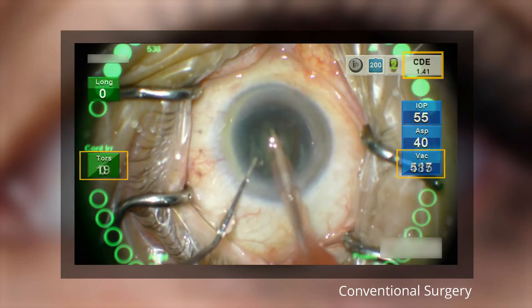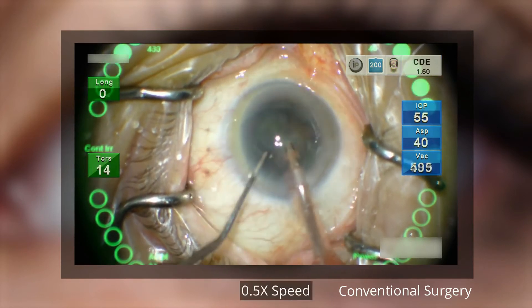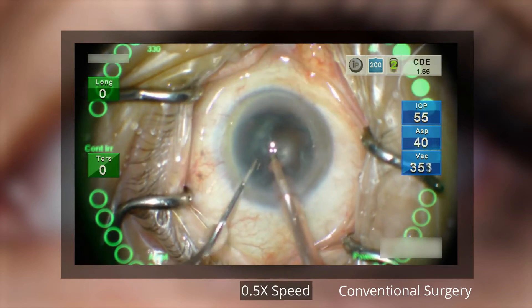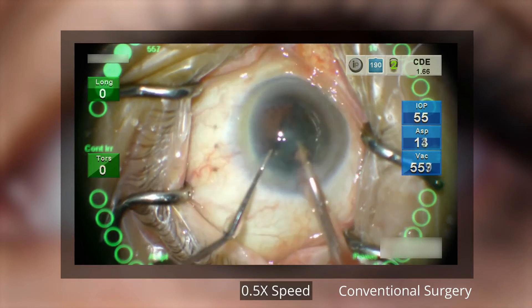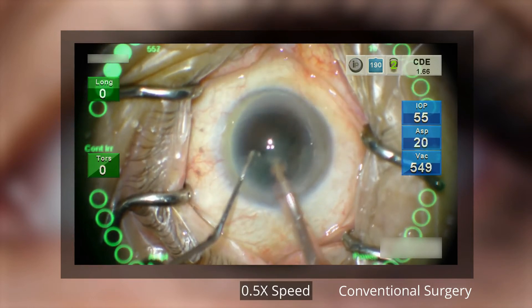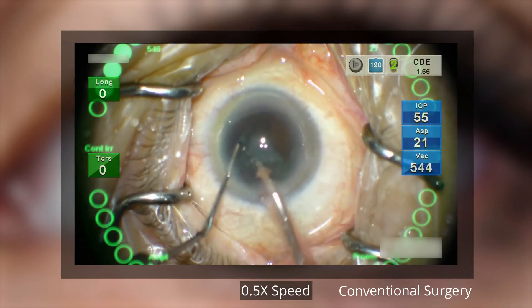The torsional ultrasound power is delivered when the vacuum is engaged. Irrigation flow from the sleeve is directed to the sides, which is important for avoiding flow towards the cornea, which in turn could minimize endothelial cell loss. Once phacoemulsification is complete, the surgeon prepares the eye for the IOL implant.